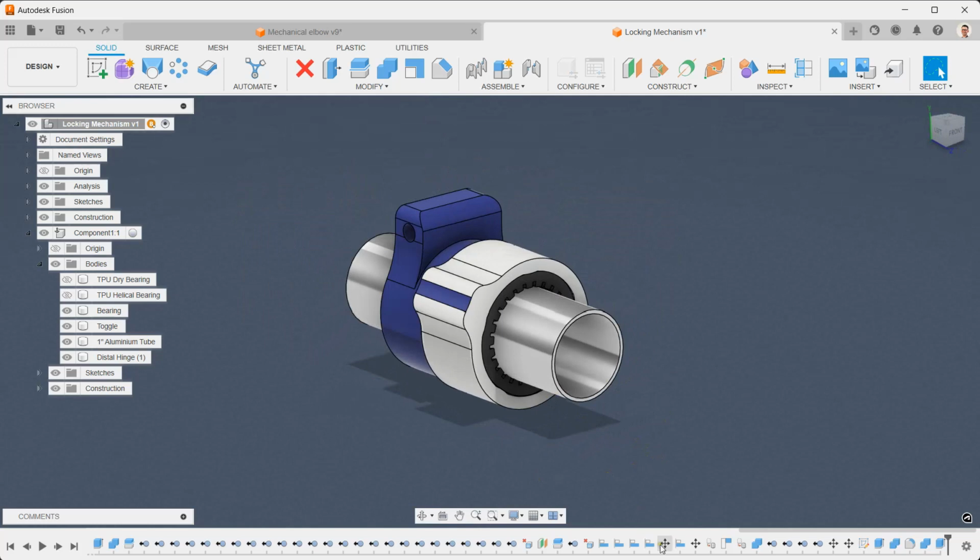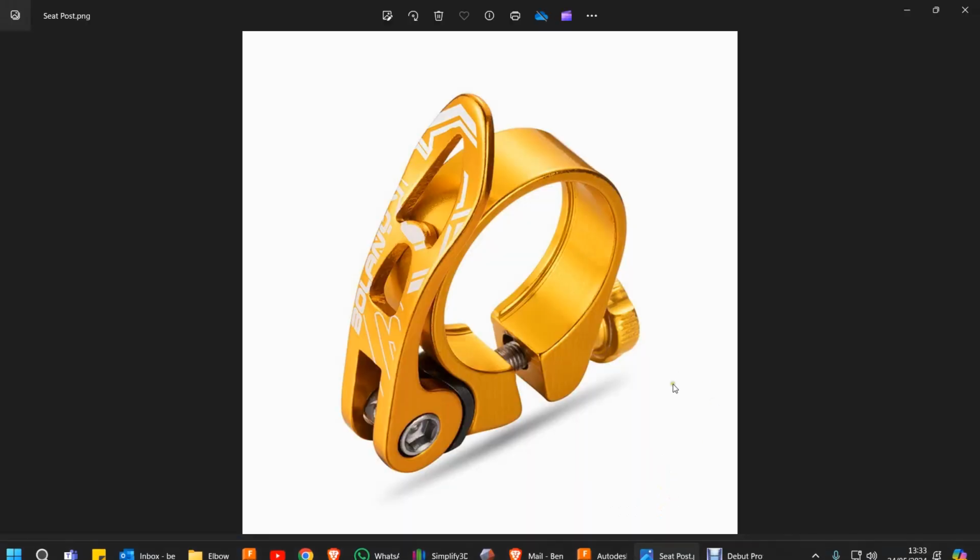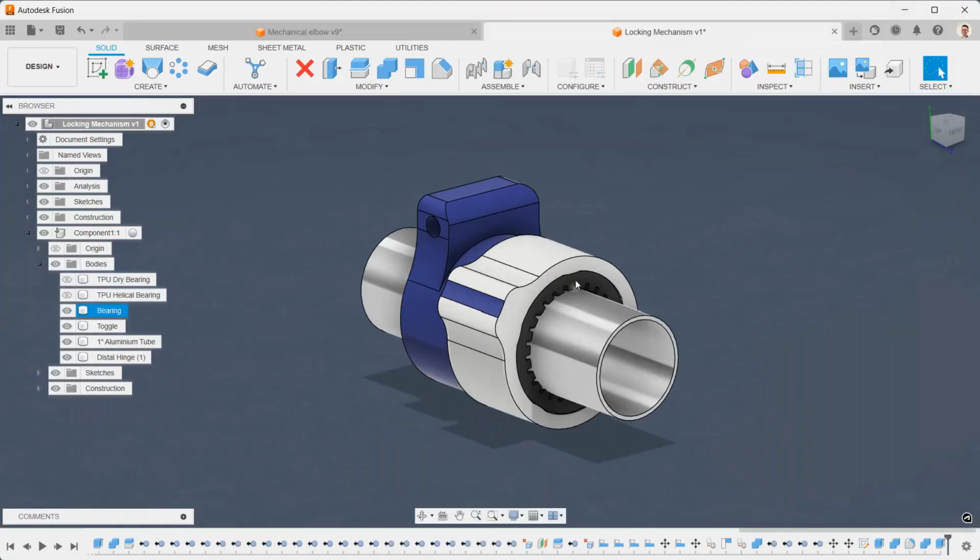I've actually incorporated it. One of the go-to pieces of advice that I'm probably going to have to fall back on, in case it goes wrong, is to just switch to a quick release seat post clamp. That would eliminate any need to do any design work other than to marry this up to something that fits to the bearing.